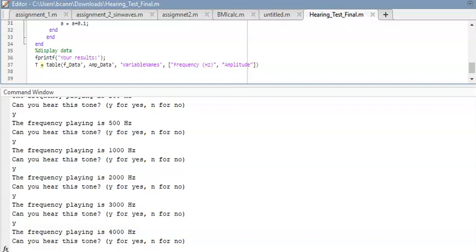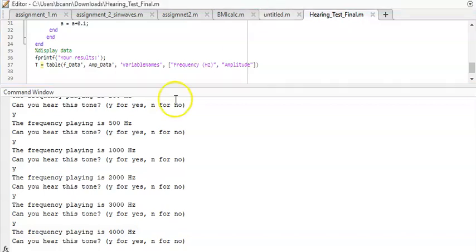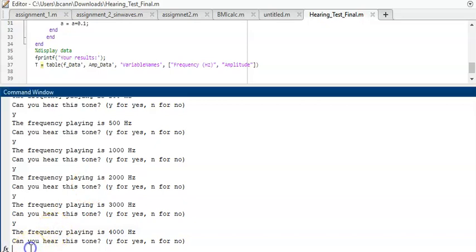Hi, I'm John McElhenney, and I'll be demonstrating our hearing test from the user's perspective, starting at 4,000 Hertz.